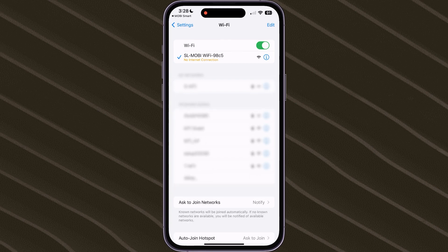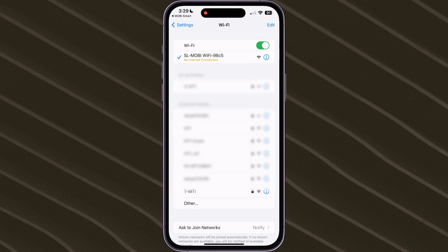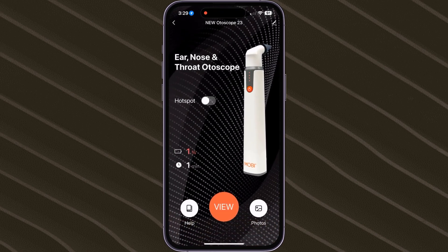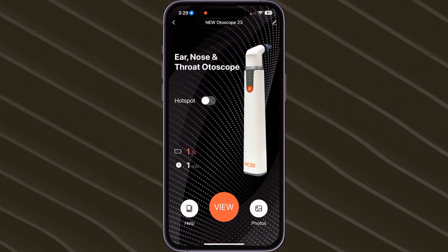Once successfully connecting to the Otoscope's hotspot connection, return back to the Mobi Smart app. Please allow 15 seconds for the device to sync with the new network. You'll notice that the status bar for the hotspot will switch from grey to orange.